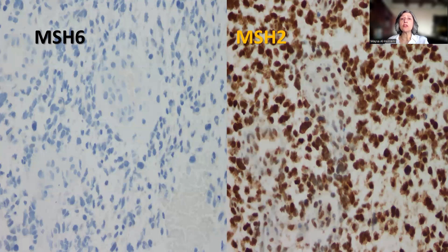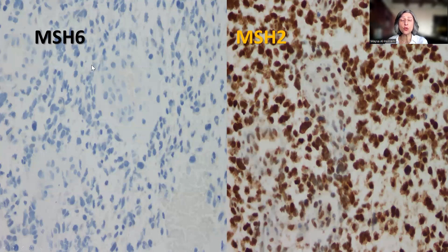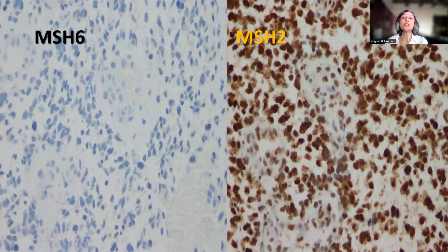However, in constitutional mismatch repair deficiency syndrome — also called biallelic mismatch repair deficiency syndrome — there is loss of nuclear staining in the normal tissue, including the vessels, as well as the tumor cells. The first reaction would be that the stain is not working and needs to be repeated, because one expects a positive internal control. In CMMRD, there is loss of both alleles by germline mutation, resulting in loss of protein expression in both normal and tumor cells.